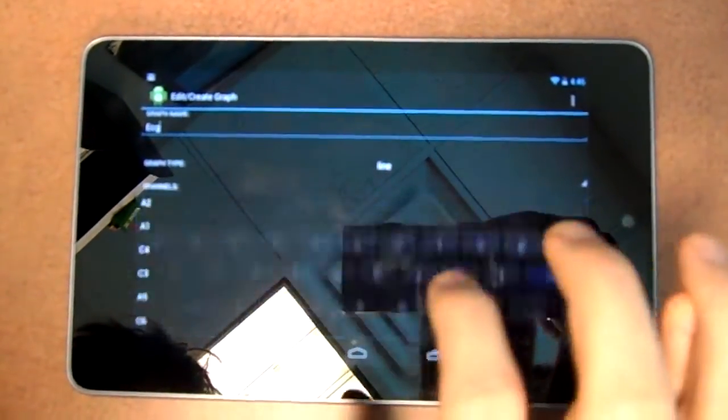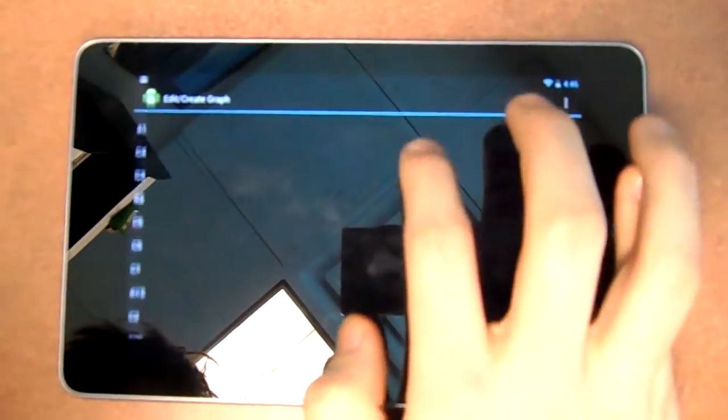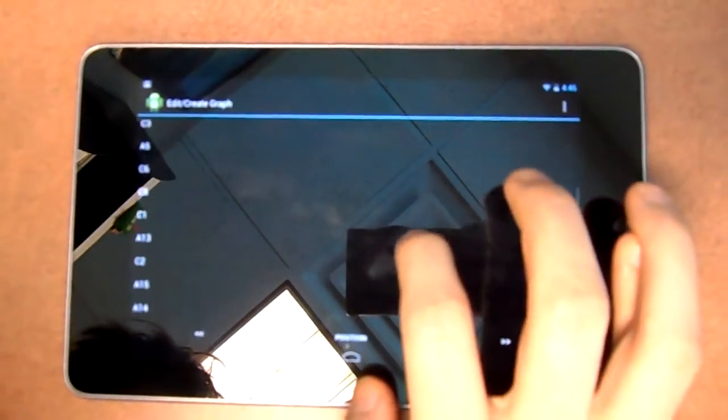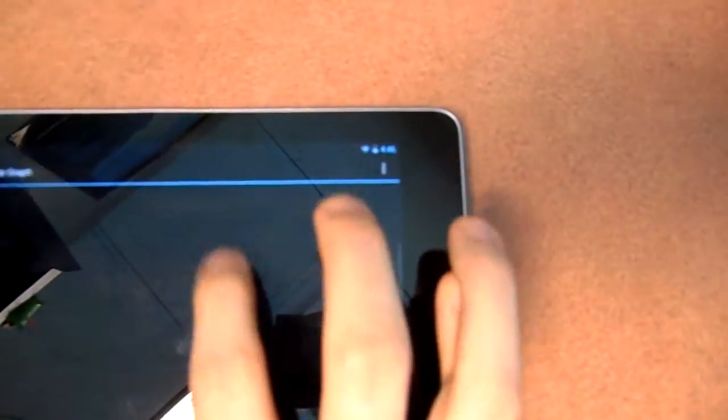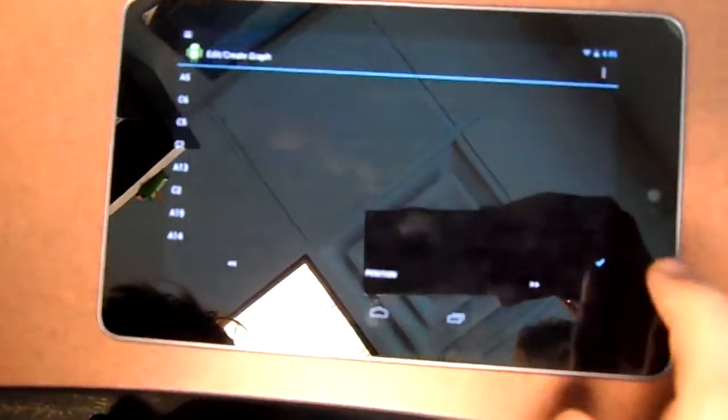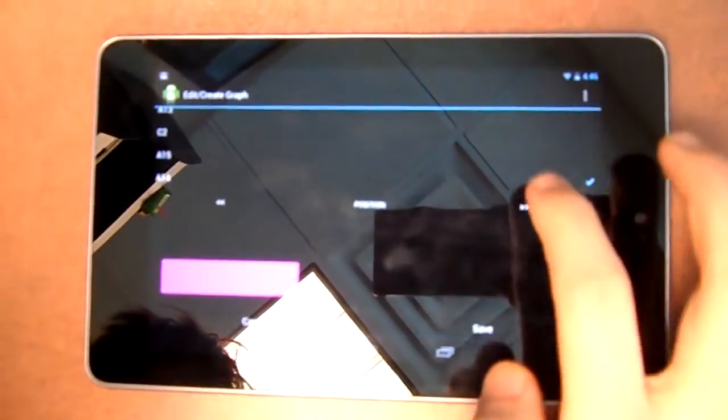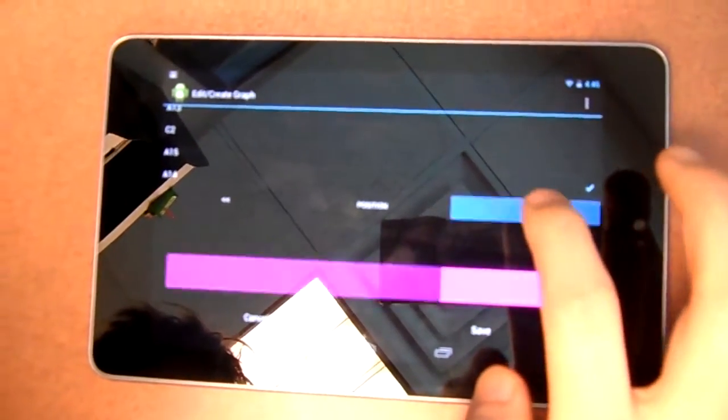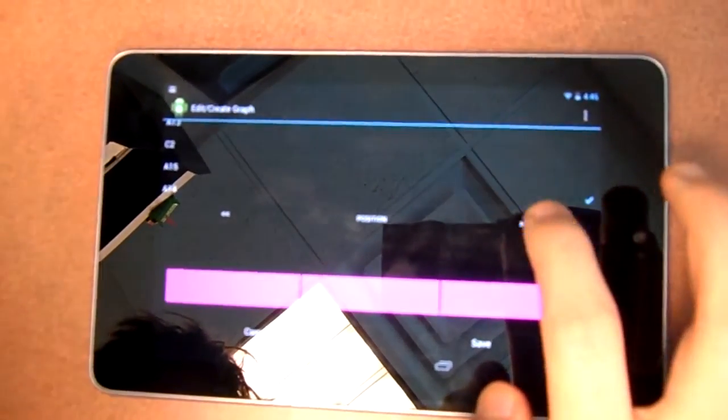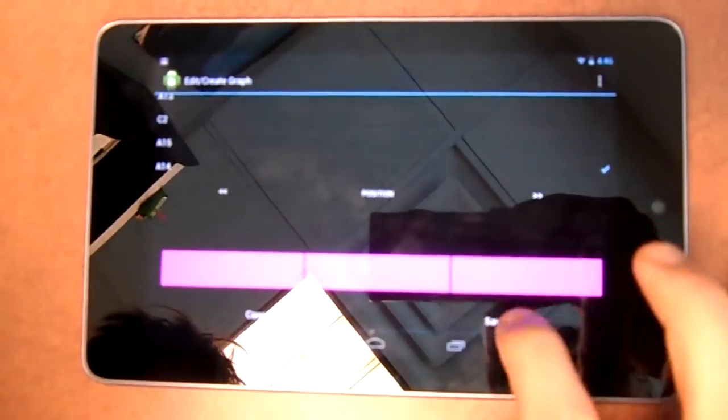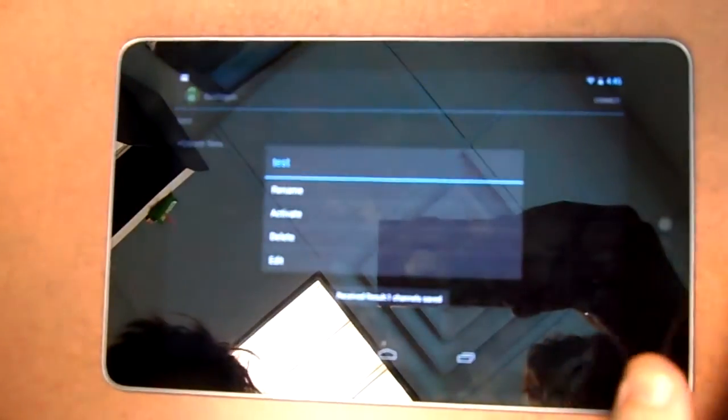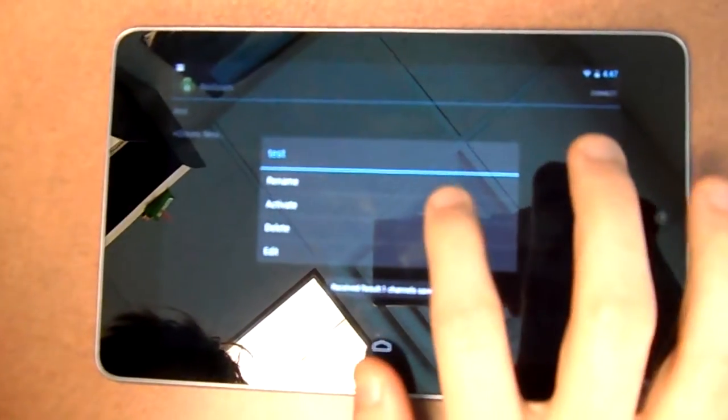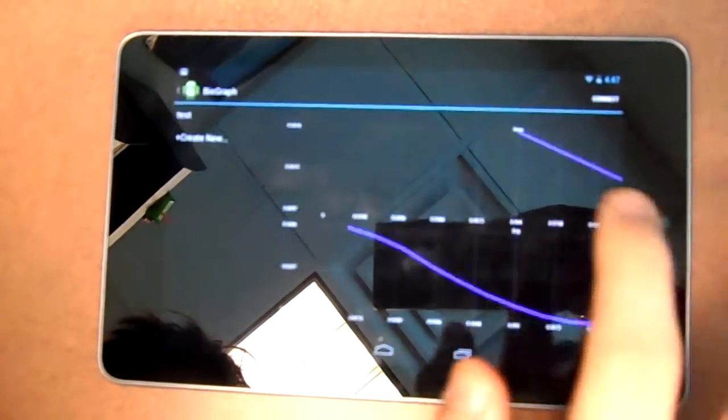This one is connected on channel a14. That one we want to be all the way along the bottom. Click Save as such, then we want to activate it to actually view the data.